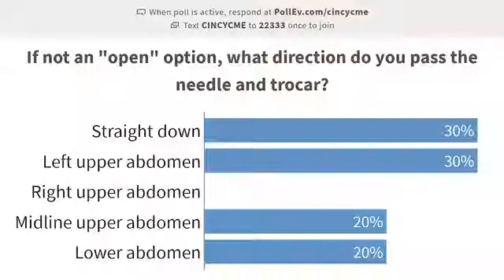All right. I think you touched on the reasoning for not going straight down, but it's because in whatever direction you want to go outside of straight down, you've got much more space to insert the trocar and the cannula. Yes. And if you go straight down when you put your telescope in the first time, oftentimes I notice people start looking around, did I poke a hole in something?